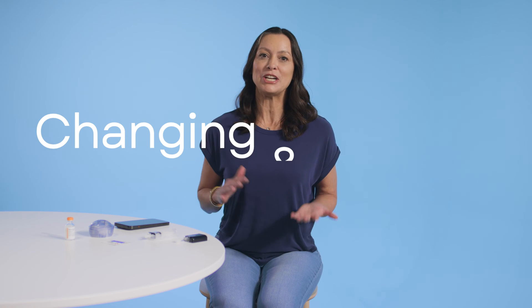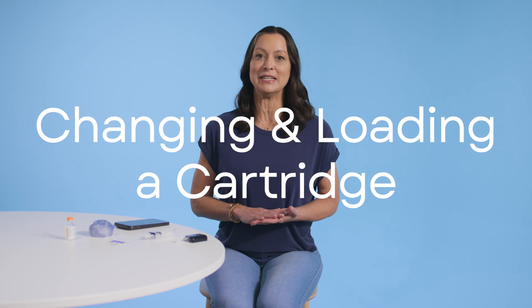Hi, I'm Christy with Tandem Diabetes Care. Today we're going to talk about changing a cartridge and loading a new one on your Tandem Mobi insulin pump.